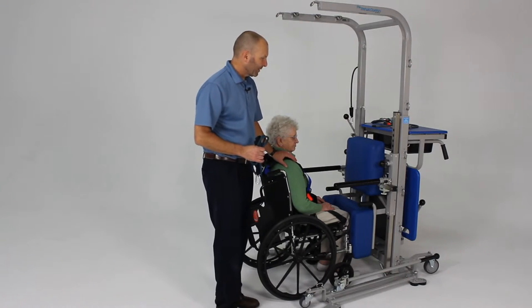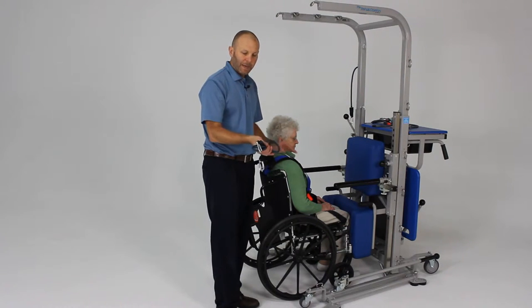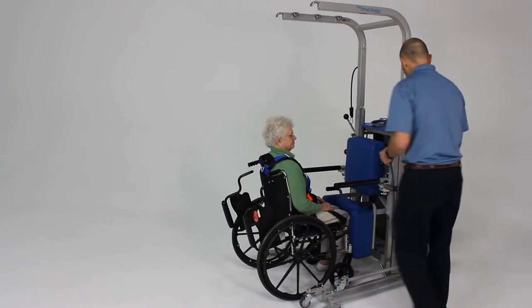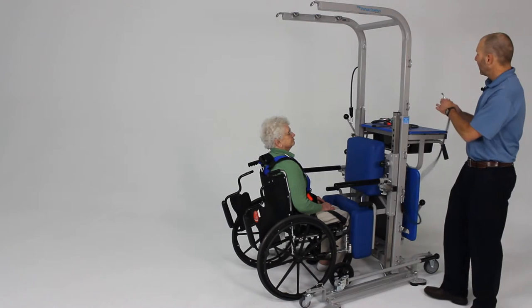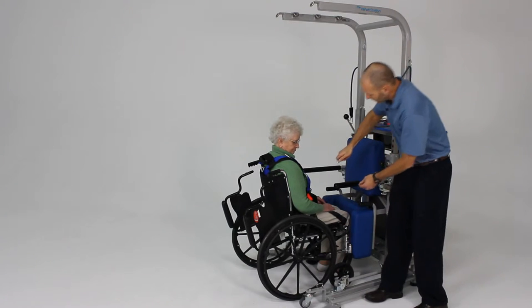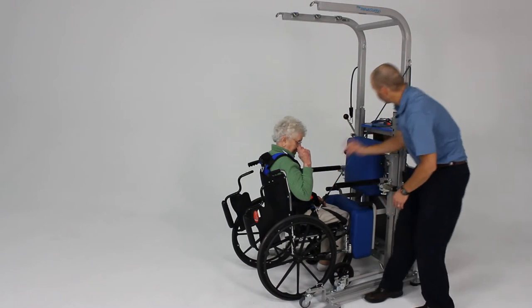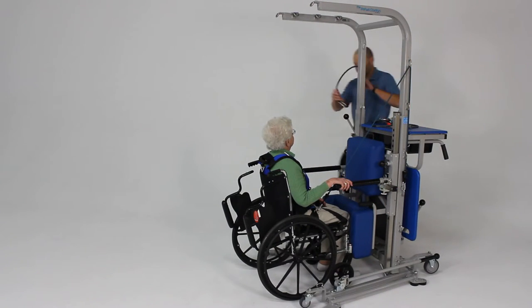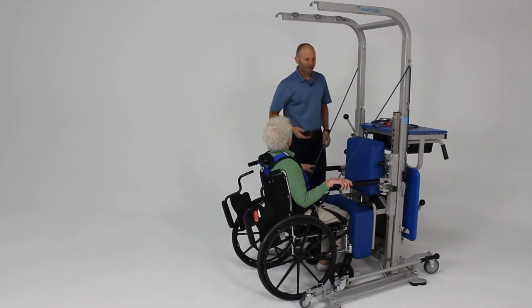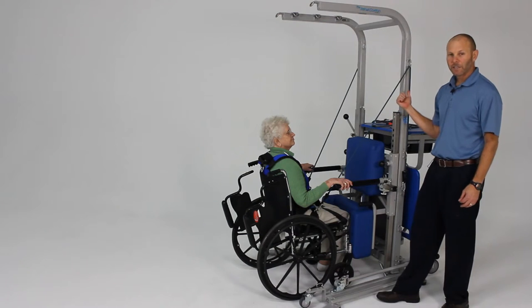This person is having difficulty even getting out of the chair under their own power, so we're going to use some bungee assisted bands to help assist with the sit-to-stand motion. We're going to clip this into the number four clip point, run this through the number one clip, and anchor this down onto the pelvic support strap and the D-ring attached just underneath the hips. We'll do the same thing on the other side. That's going to provide her assistance in the sit-to-stand motion, with an angle in that position to bring the hips into extension.